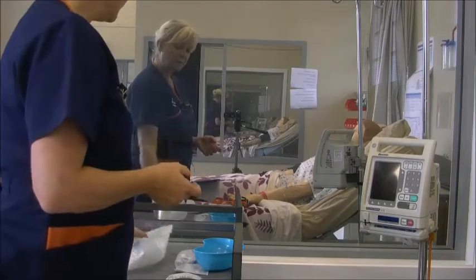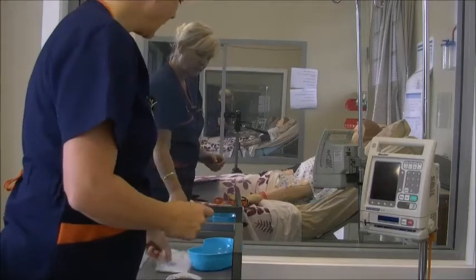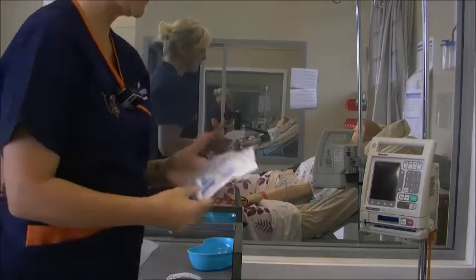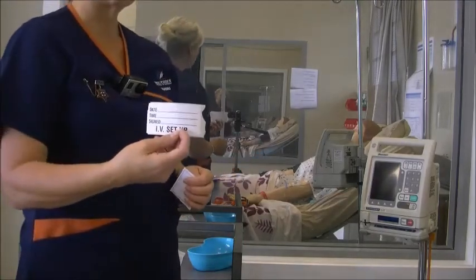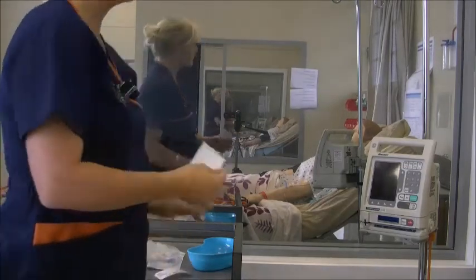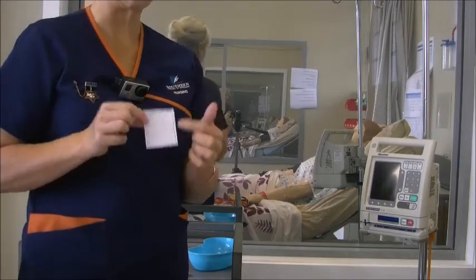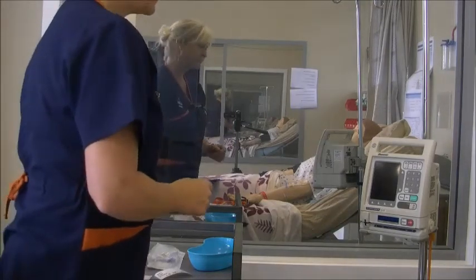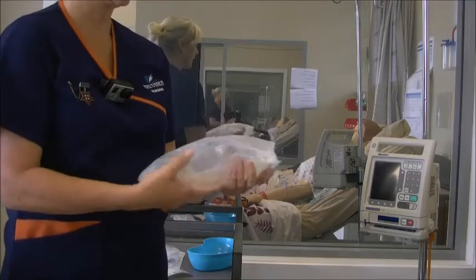So what I've got here is some normal saline. I've got some tubing that I'm going to connect to the bag so that I can connect it to my patient. I've got an IV label to put onto the tubing so that the next person knows how long that tubing's been hanging up there for. And I've got an intravenous therapy label which I'm going to fill out with my patient's details and all the information that you need prior to putting the bag up. So I know that my patient needs a litre of IV saline, so that's what I've got here.